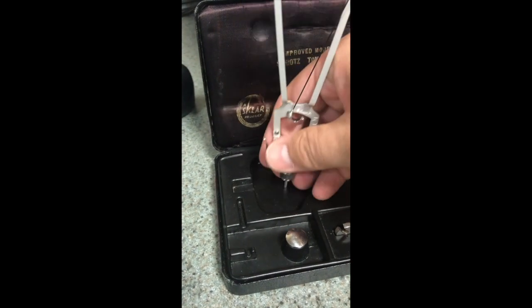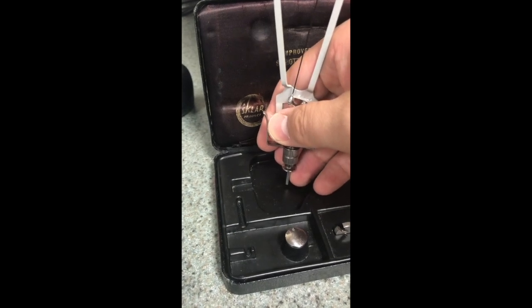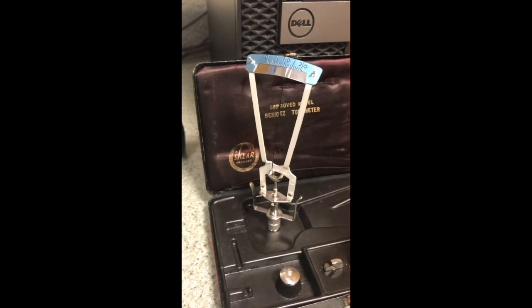And then the little plunger down here where my ring finger is — that actually will help to measure the intraocular pressure, and it is what actually moves the scale.